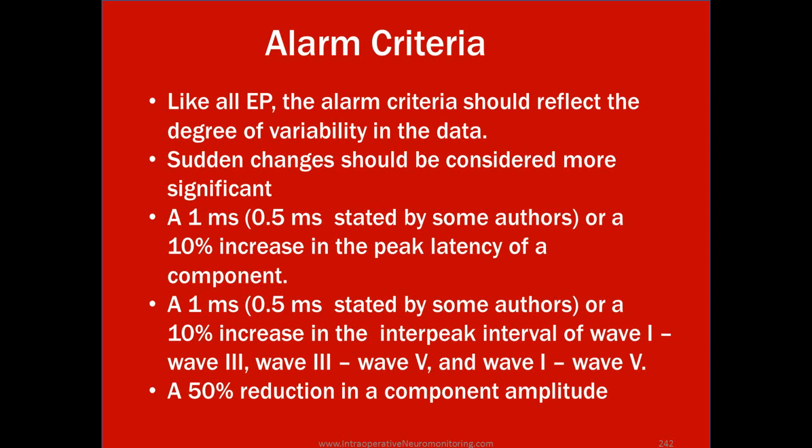Another criterion is a 1 millisecond or 0.5 milliseconds, as stated by some authors, or a 10% increase in the interpeak interval of wave 1 to 3, 3 to 5, and 1 to 5. And the last one is a reduction of 50% of the amplitude.